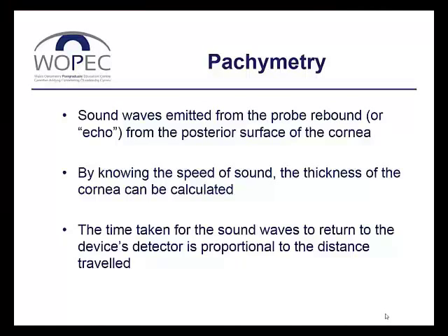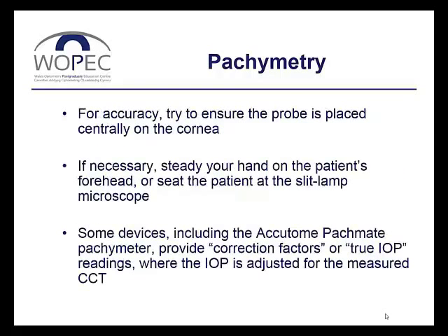Sound waves emitted from the probe rebound from the posterior surface of the cornea. By knowing the speed of sound, the thickness of the cornea can be calculated. The time taken for the sound waves to return to the device's detector is proportional to the distance travelled. You should remember to try and place the probe centrally on the cornea, and if necessary, you can steady your hand on the patient's forehead or, alternatively, seat the patient at the slit lamp microscope.